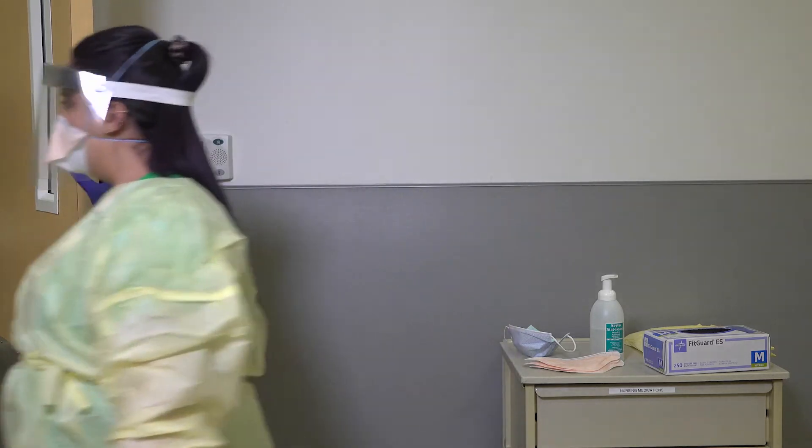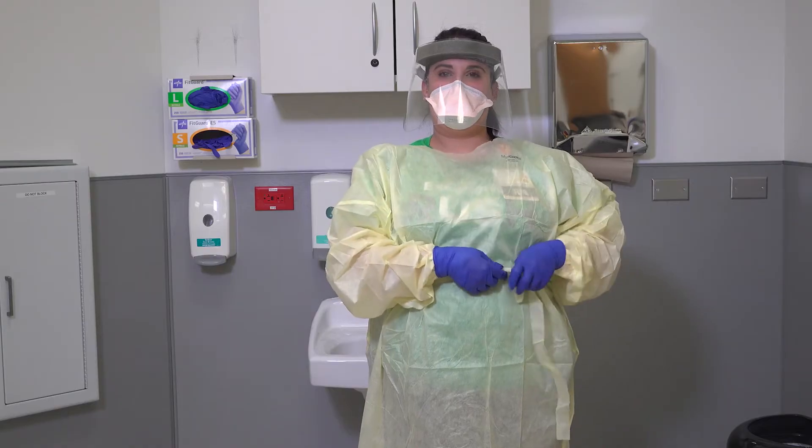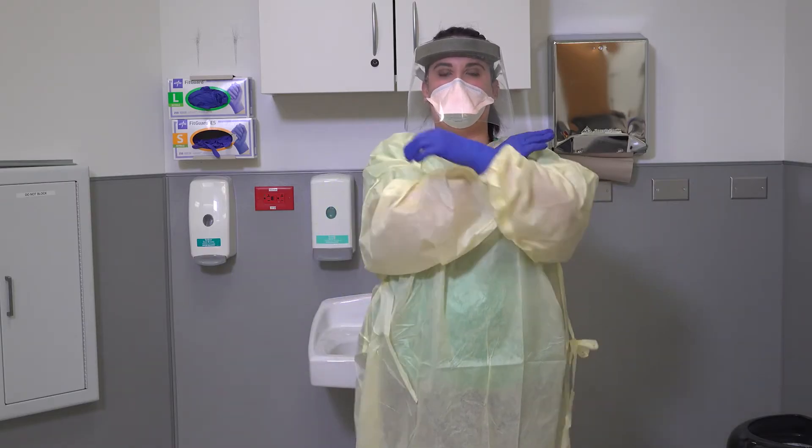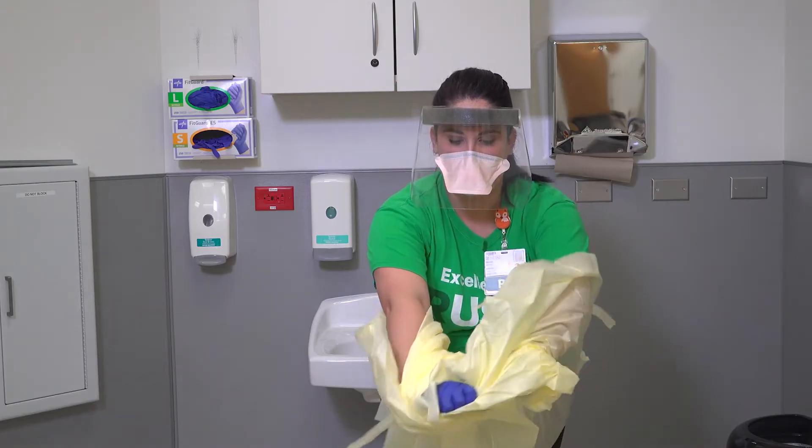You may now enter the isolation room. When you are ready to exit the isolation room, begin the doffing process inside the room at the threshold of the door. Remove your isolation gown first by breaking the tie at the waist.